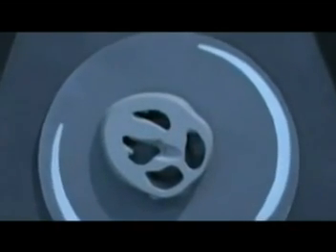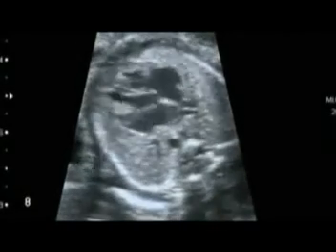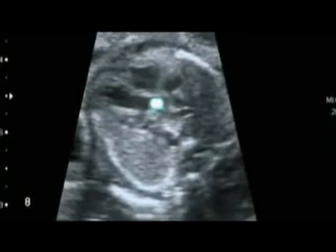When the baby's in this position, you'll get a pretty good view of the aortic outflow because it's running perpendicular, more or less from left to right across the chest. So obviously you think of the aorta as a left ventricular structure, but it rapidly goes from the left side of the baby across to the right side of the baby. When you're scanning with the baby in this position, you'll see the aorta pretty clearly as a long structure because there's something for the scan beams to bounce off. Aortic valve running into the aortic outflow.